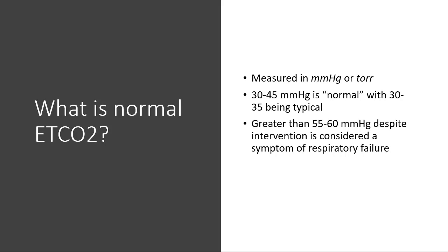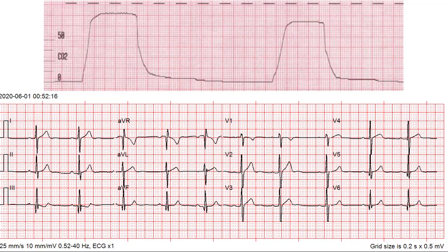So I have compared previously in this lecture End-Tidal CO2 to EKG, in that we need to look at it in the same structured fashion. And I think this image, where you see the graph paper and you see the End-Tidal CO2 and the EKG on graphs, kind of drives that point home. Just like with EKG, where you're looking at shape, width, and speed, this is time, this is height. Just like with EKG, you're doing the same thing with End-Tidal CO2.